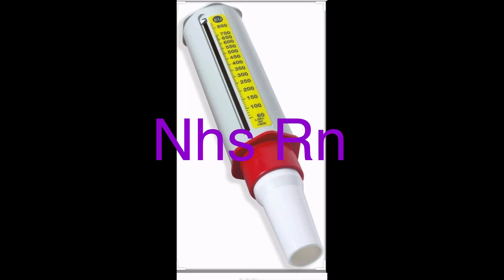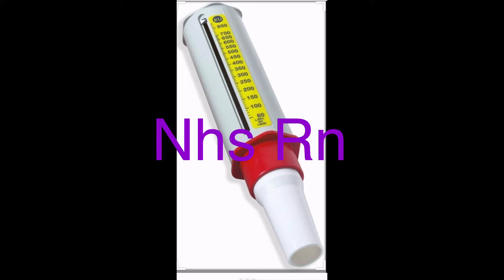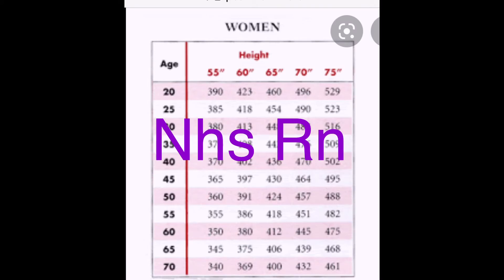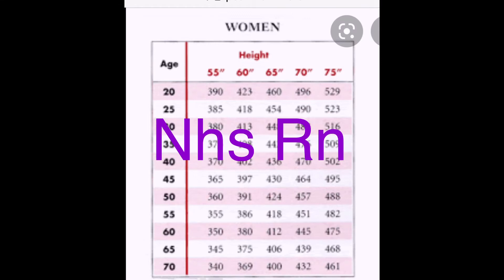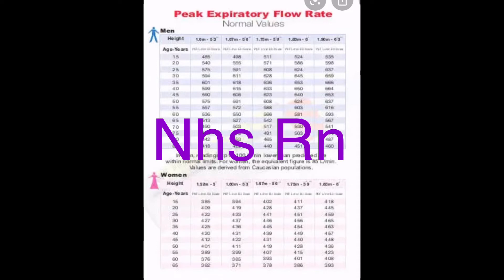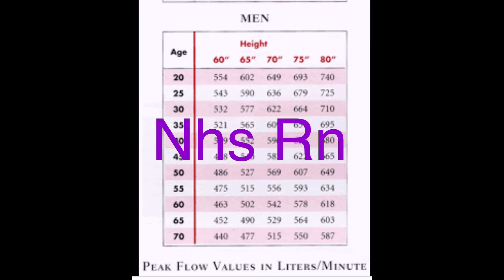For peak flow, you can say: 'Peak flow measures your peak expiratory flow, which is the highest flow of air achieved on forced expiration. This will assist us and you to monitor your respiratory condition and the effectiveness of your medication.' Explain this in simple terms and make sure the patient understands what you are going to do.